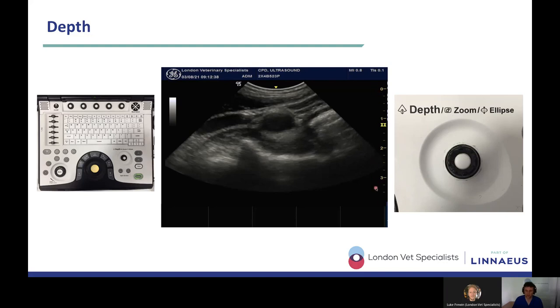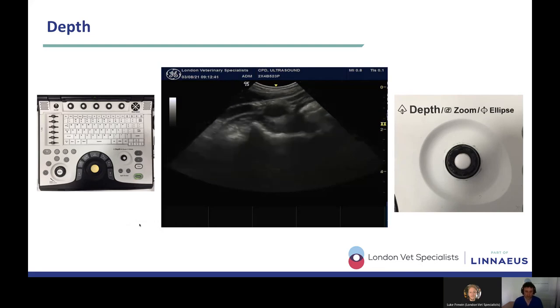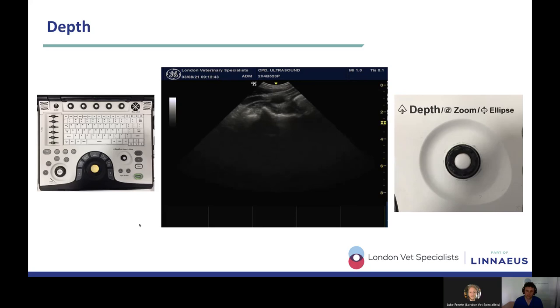So here we've got 3 centimeters depth. And if we play around with it, then that's going to change. So let's see what happens when we start fiddling about with our depth. So that's increasing the depth.